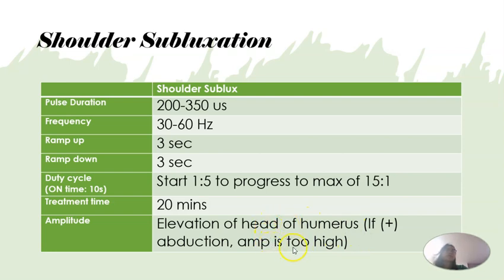What we want is only the head of humerus elevating.